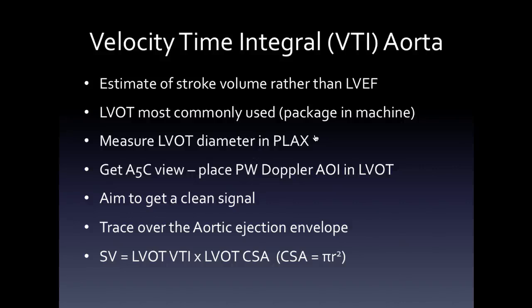Certainly I don't use this as a routine tool. And putting the talk together, I had to scramble a little bit to get my slides together for this particular. So the idea is that you're looking at stroke volume rather than left ventricular ejection fraction. So you're using stroke volume, then you work backwards to get LVEF.